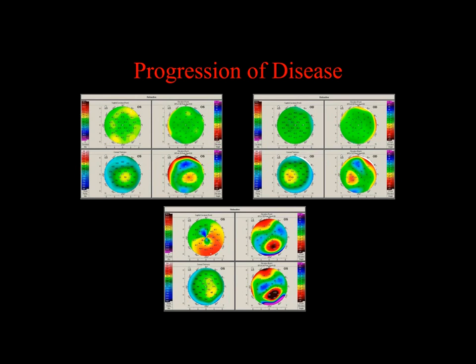So you have an ectasia on the back surface that causes thinning as we expect, and that posterior ectasia corresponds to where the thinning point has been displaced, but a completely normal anterior surface. These upper two are subclinical keratoconus.